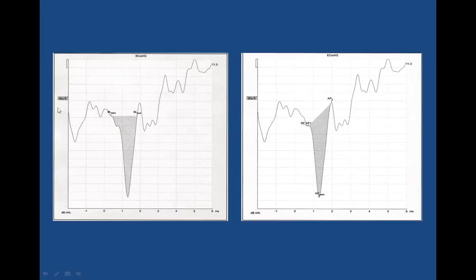In a minute, I'll show you the little side panel in terms of how we measure this. You're probably familiar with it anyway. What we do is select the point where we believe the SP begins. This is the 0 point here. And in our experience, especially in normal ears and even in abnormal ears, since the SP represents the onset of the signal being transduced in the cochlea, it generally starts anywhere from 0.3 to 0.5 milliseconds beyond the onset of that stimulus. You can take that to the bank.